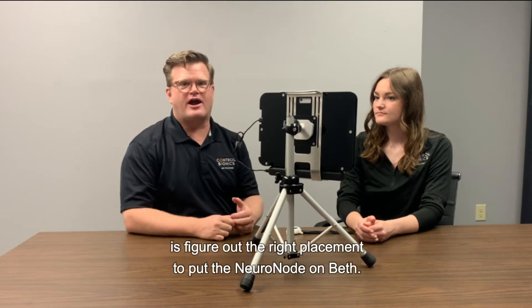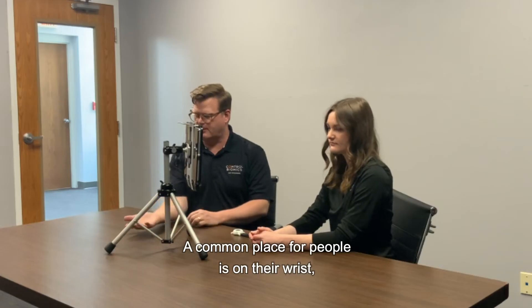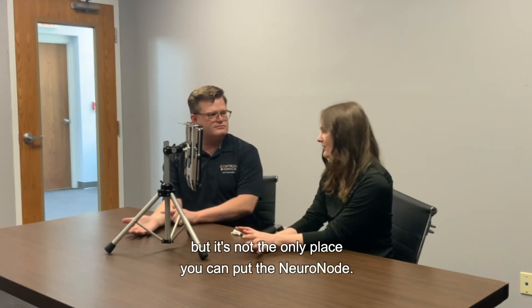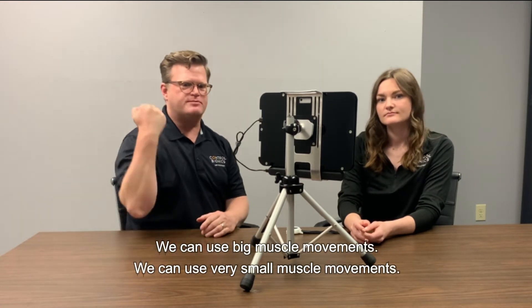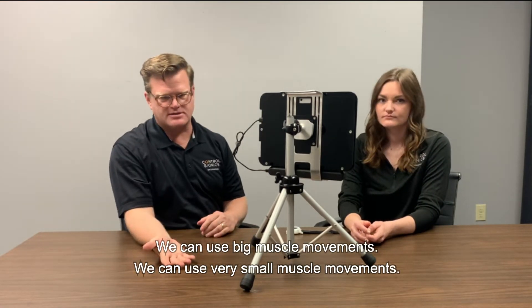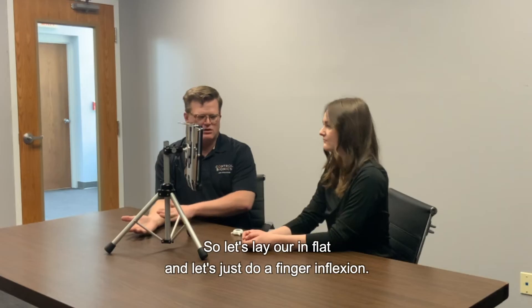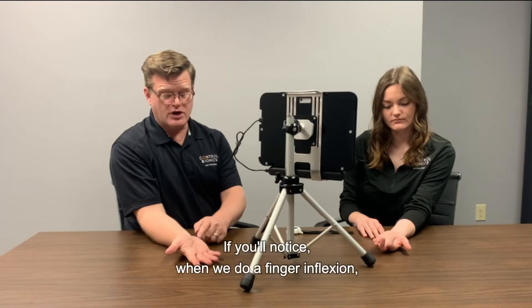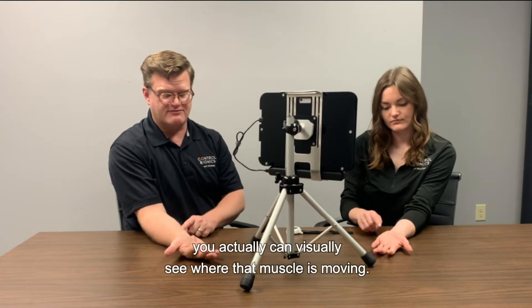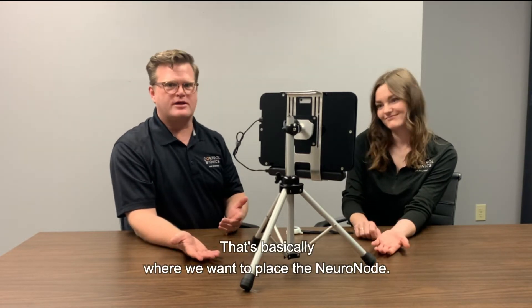The first thing we're going to do is figure out the right placement to put the NeuroNode on Beth. A common place for people is on their wrist, but it's not the only place you can put the NeuroNode. We can actually use any type of muscle movement — big muscle movements or very small muscle movements. We're really measuring the intent of that muscle movement. So let's put our hand flat and do a finger flexion. If you'll notice when we do a finger flexion, you can visually see where that muscle is moving. That's basically where we want to place the NeuroNode.